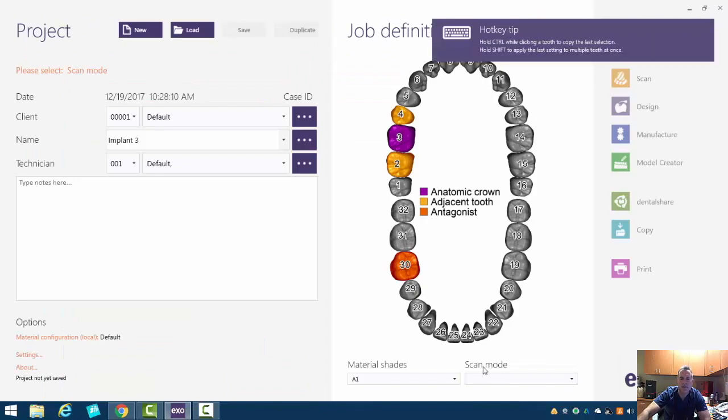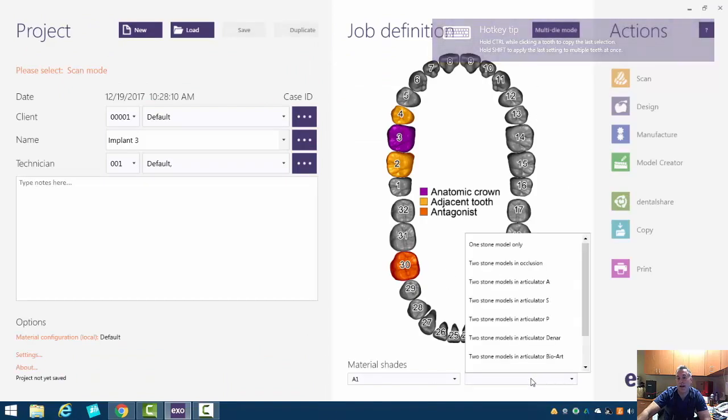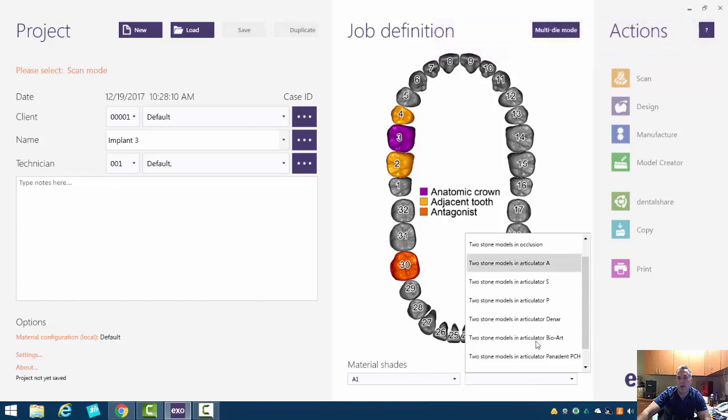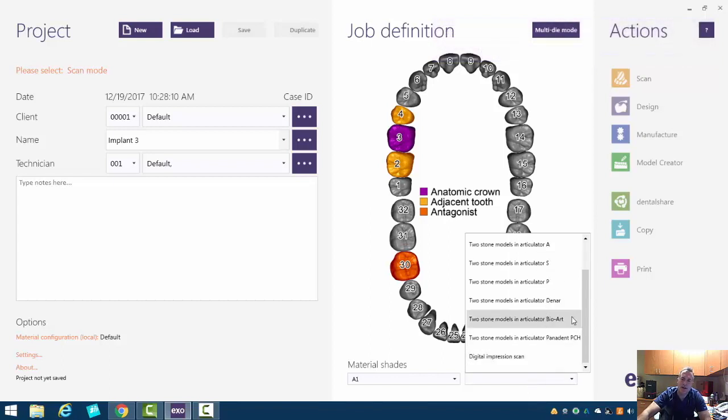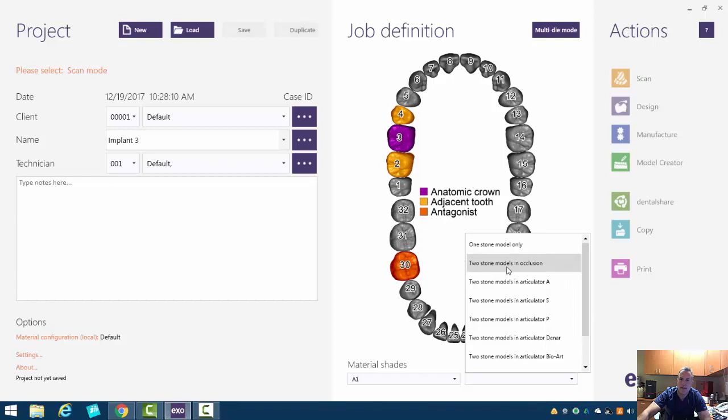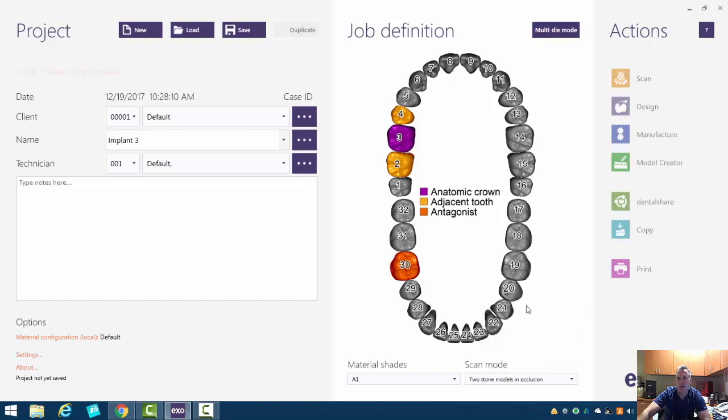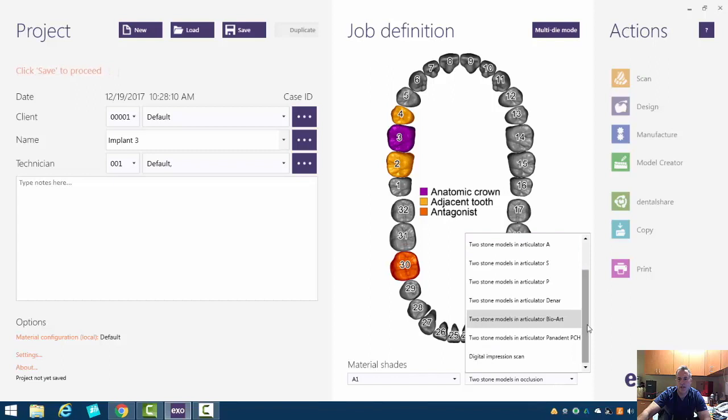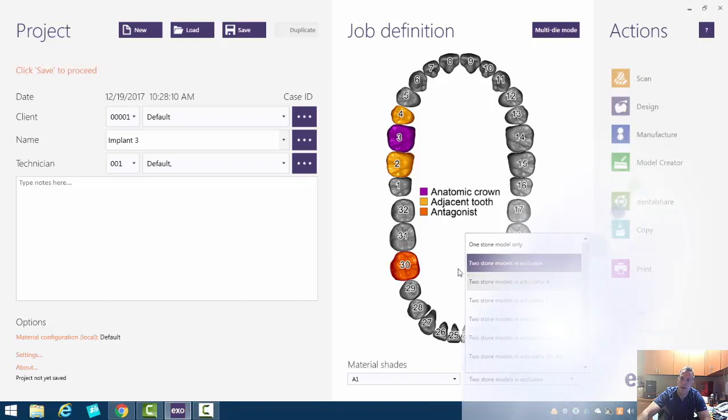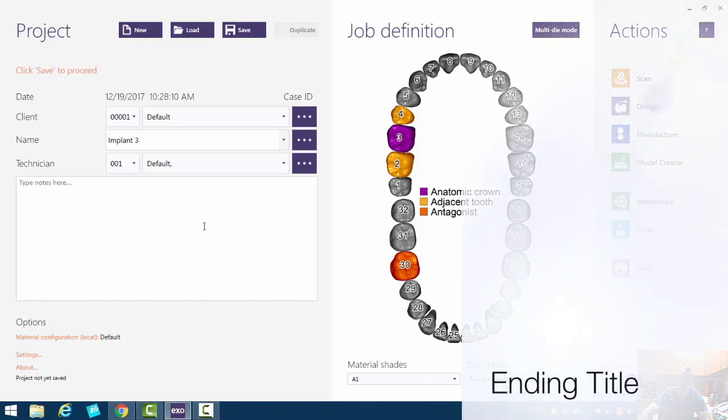Let's also tell ExoCAD how we want to articulate these models. So in this case here, we've got basically two stone models in occlusion. There is an option here for digital impression scan. That's physically scanning an impression to invert it. So we'll click that and we'll hit save.